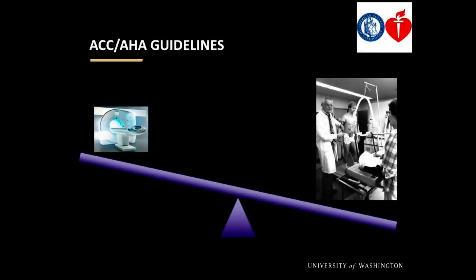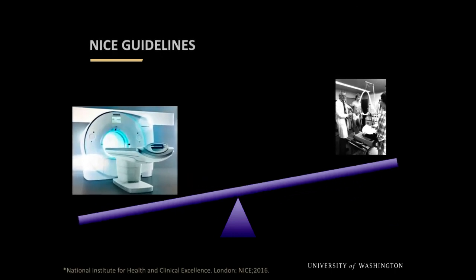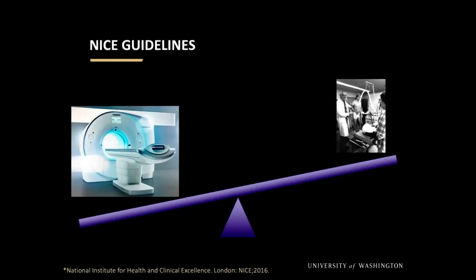You have here Dr. Bruce, who's really the pioneer of exercise cardiology, and with the ACC guidelines, really the focus is on exercising your patient. And this treadmill test has really stood the test of time. And then you go over to the UK and you see that the CT scanner in the last couple of years is really your first line test for the evaluation of chest pain. So it's a really major difference in how we approach chest pain here versus how they do it in the UK or in Europe.